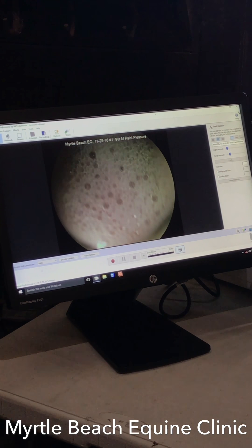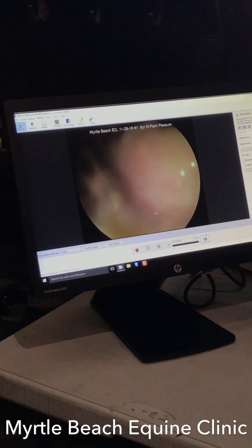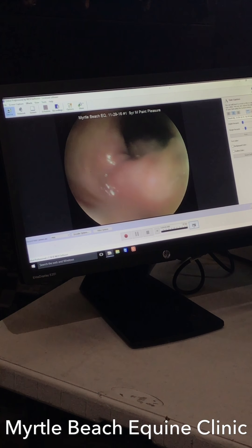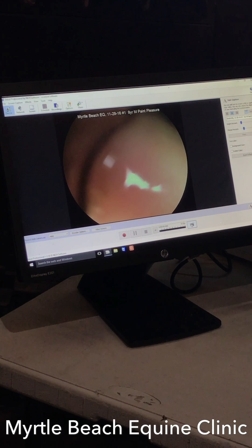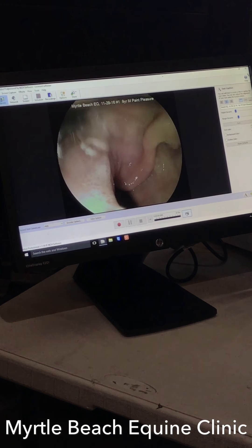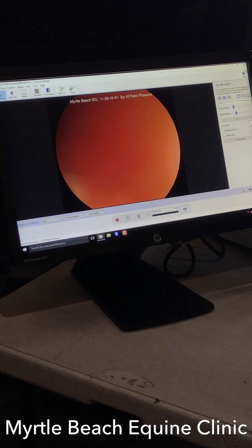We're going to go ahead and see the pylorus here in just a second. There we are — there's the pylorus. Go ahead and advance it while we have the pylorus right here. Now we're in the upper part of the small intestine.